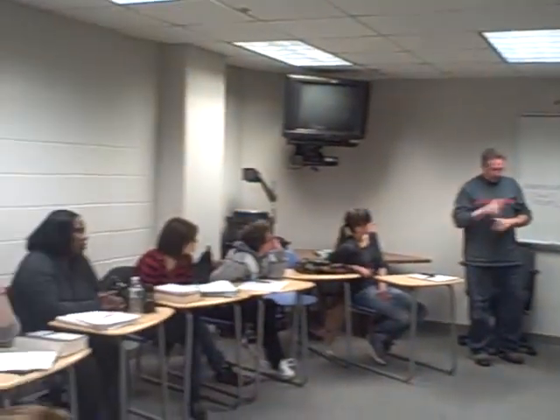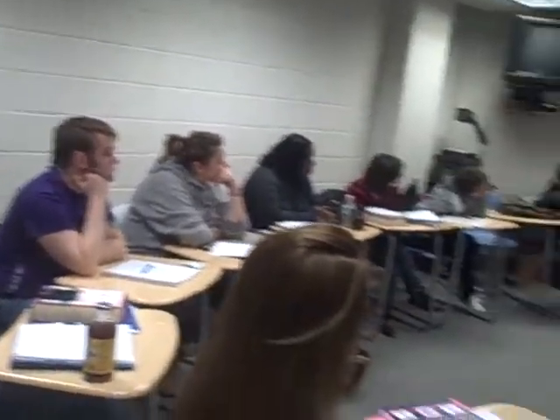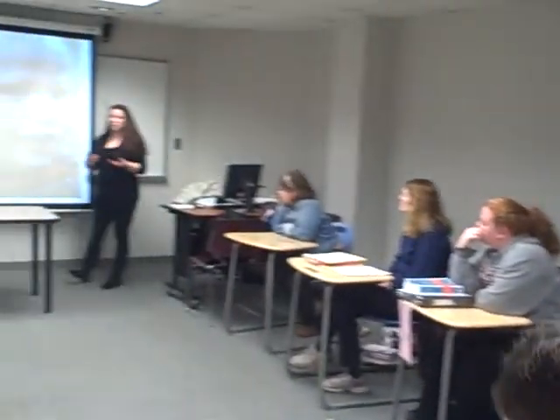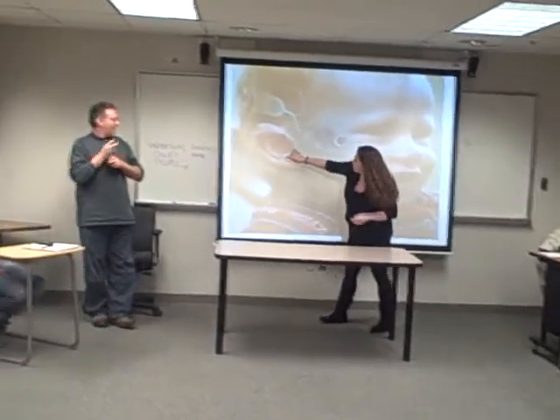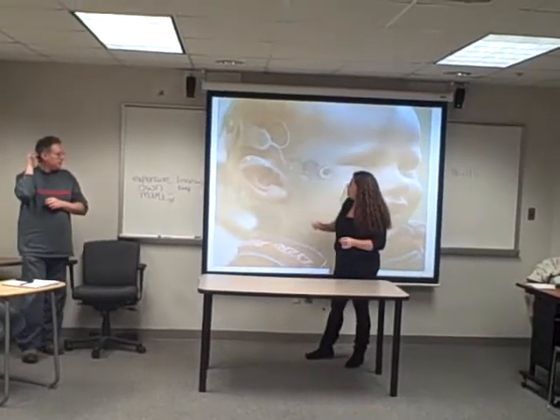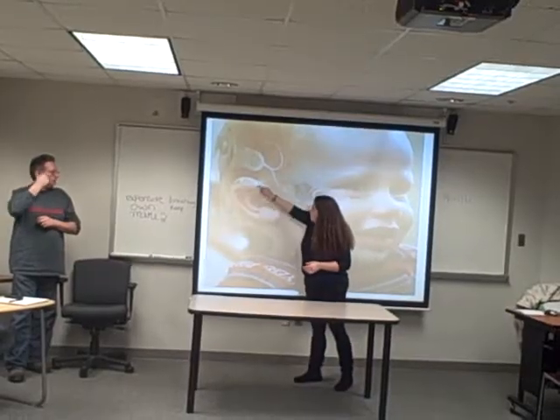So, this is a picture, a very large picture, of an implanted child with a cool little diagram of what's going on inside. I'm going to explain to you the components of the implant. It has 2 pieces, internal and external. It's a little hard to see, but back here is a microphone. They're typically worn behind the ear, but not always. He has a grip to keep it on his ear. My daughter doesn't have one of those.